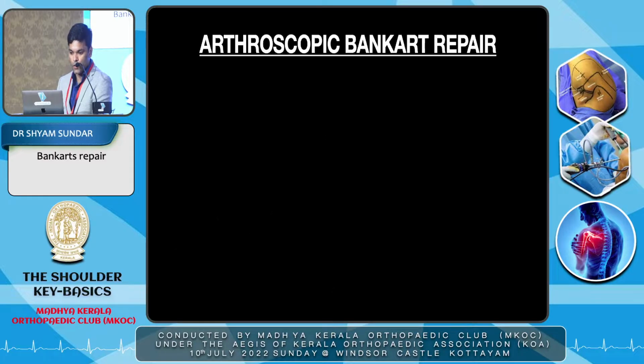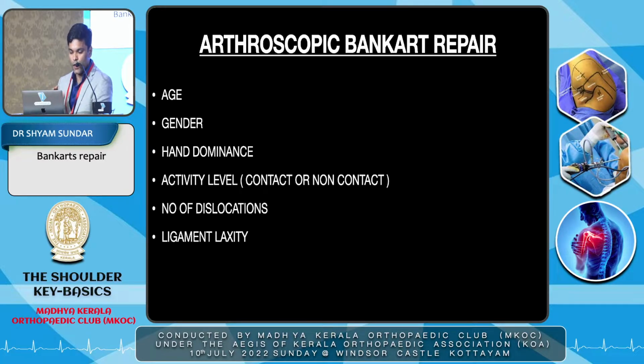Now let's go into the arthroscopic Bankart repair. I always keep in mind these factors before addressing a patient for surgery, because this is going to help me be successful in whatever procedure I do. For contact athletes, I don't do a Bankart repair. I straight away go for a Latarjet. Anyone who has an associated high demand activity level, always a bony procedure.